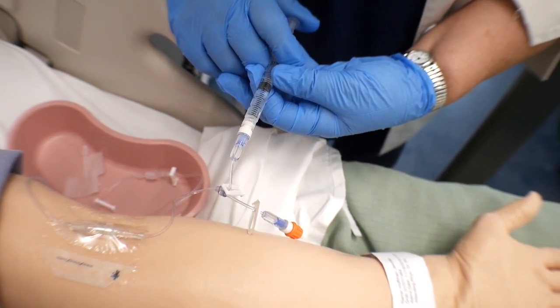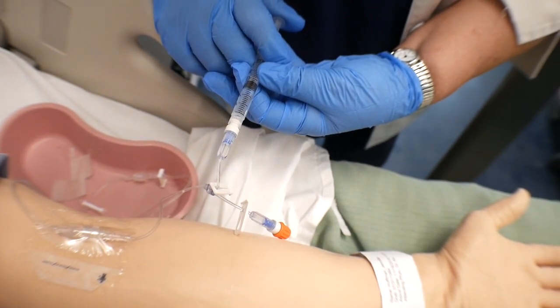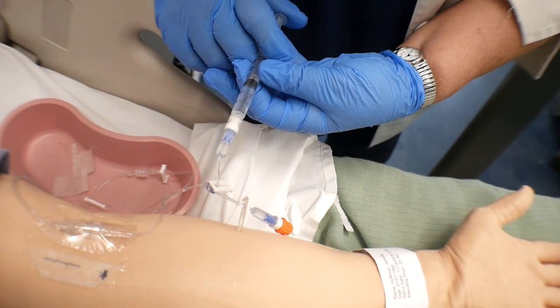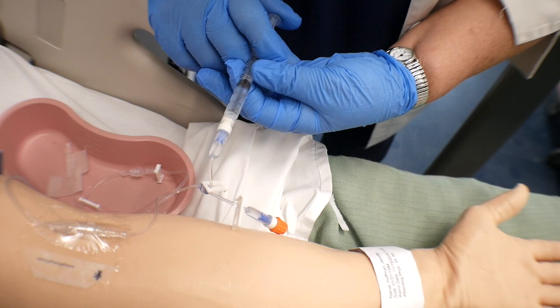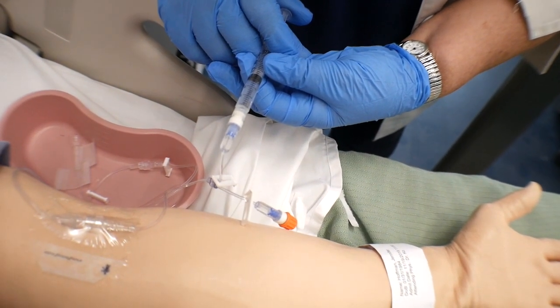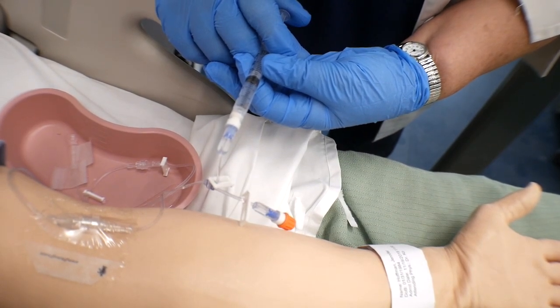So starting, 1, 2, 3, 4, 5, 6, 7, 8, 9, 10, 11, 12, 13, 14, 15, and continuing to count.